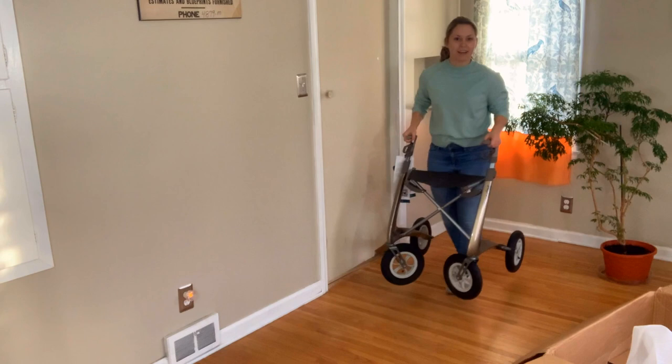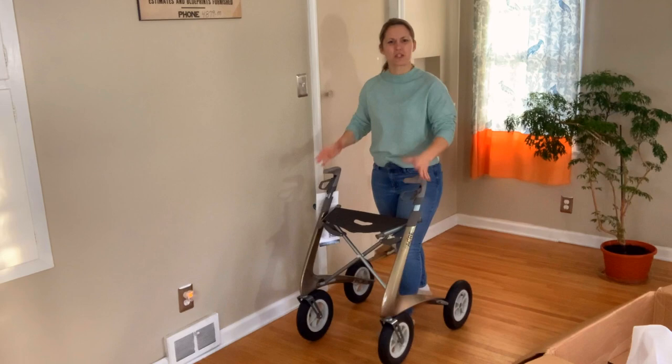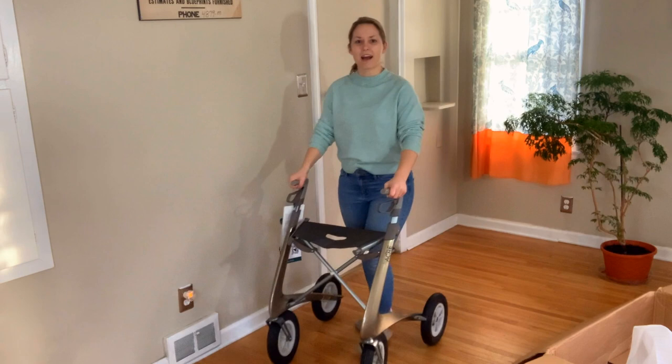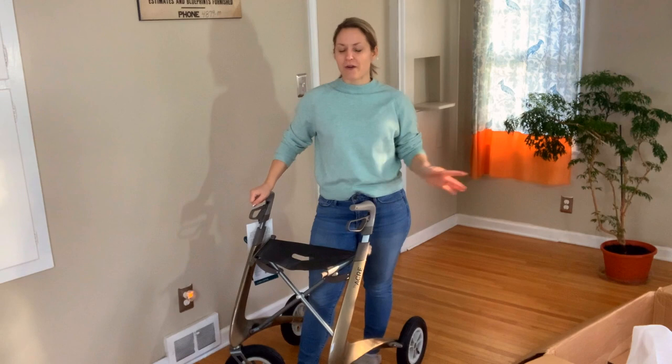I want to see how this moves — let's test it out. It just feels so sturdy. I feel secure with it. Let's back up. Very smooth ride. I am definitely going to be testing this out outdoors on various terrains, so keep an eye out for that video.